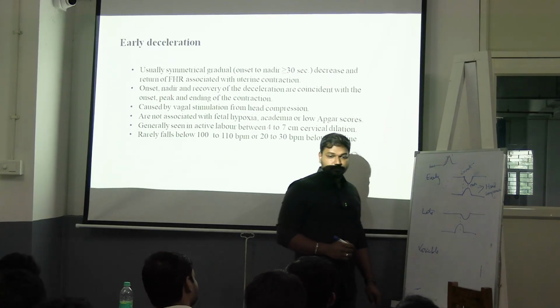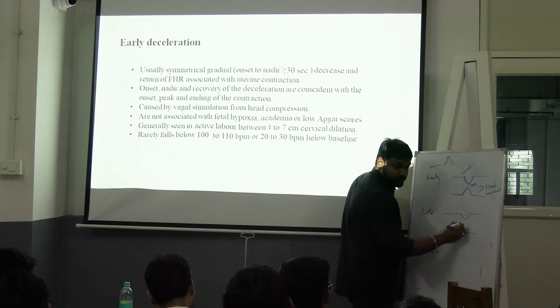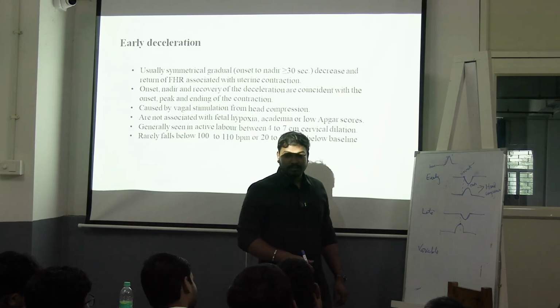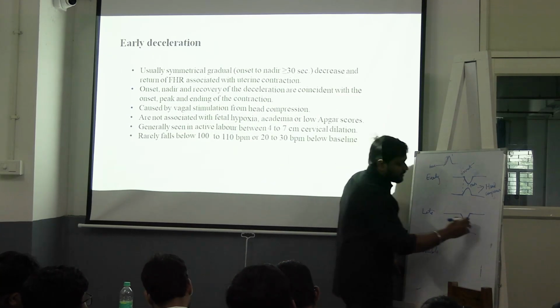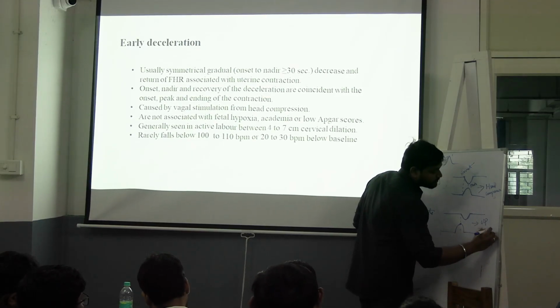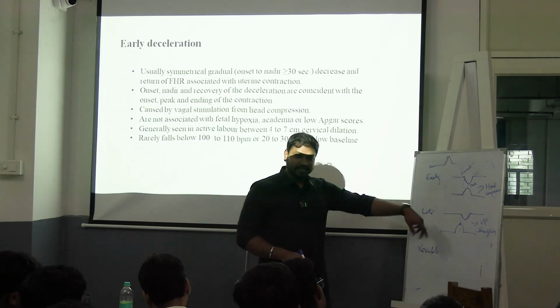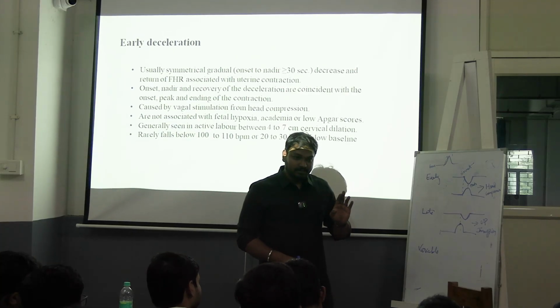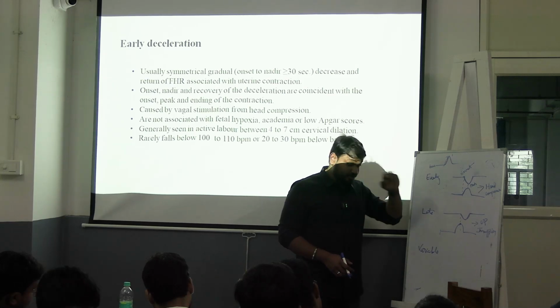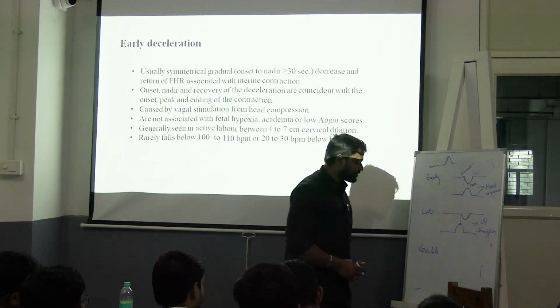This is late deceleration. So uterine contraction starts, and when it is maximum, at that time fetal heart rate starts falling. This is late deceleration. You can see this in uteroplacental insufficiency. Compulsory, this is a 1 mark in NEET. From these 3 you will get one MCQ. Early deceleration you will see in head compression. This is physiological. These both are pathological. Late you will see in uteroplacental insufficiency.